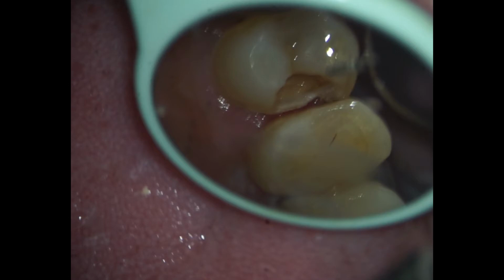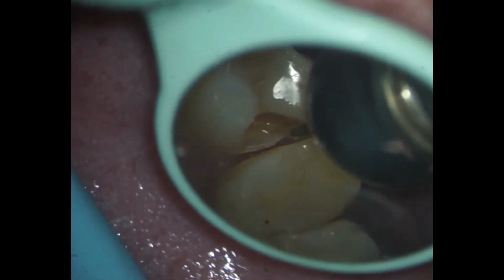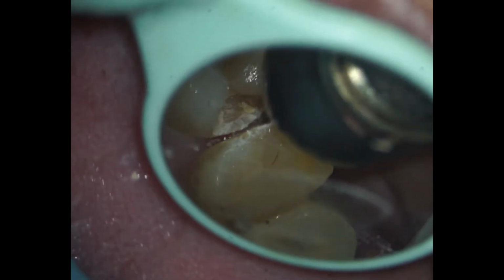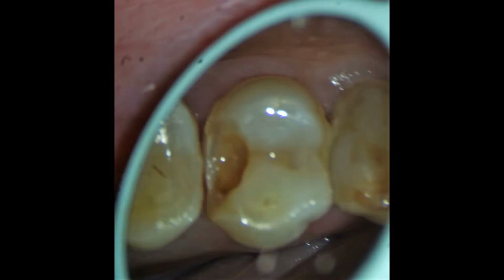Under local anesthetic, we are excavating the carious lesion. We'll apply rubber dam after seeing the extent of the lesion. Sometimes these lesions extend beneath the gingival margins. In those cases, we prefer seeing the floor of the class 2 cavity and, if needed, performing the gingivectomy before placing the rubber dam. The most important thing in class 2 which we never skip is breaking the contacts.